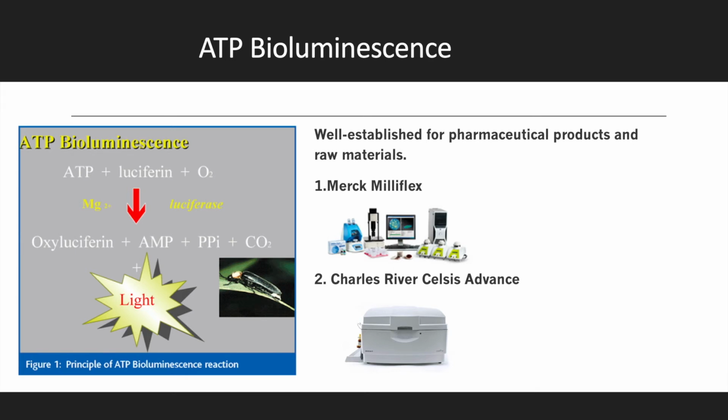Suspensions, oils, anything that can be tested using the traditional sterility testing method can be used. But the good thing about both of these methods is they are non-destructive. You can still identify your organism at the end. And the disadvantage to both of these methods, of course, is that they both have a growth phase, which adds time to your test. So it can't be done in just a number of hours, but it's still a lot shorter than the traditional sterility test.